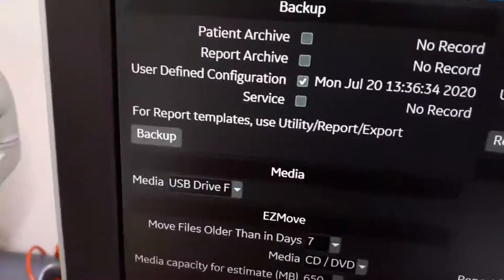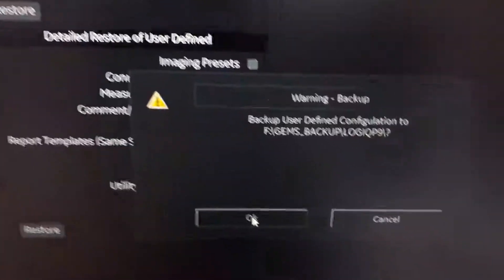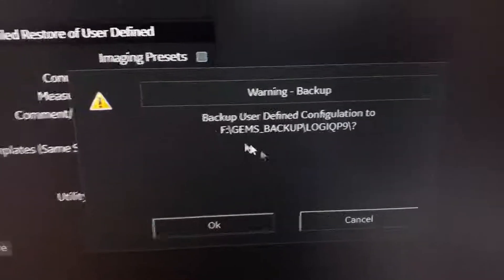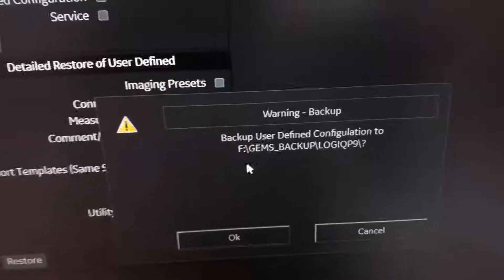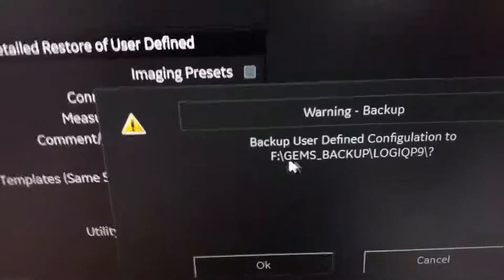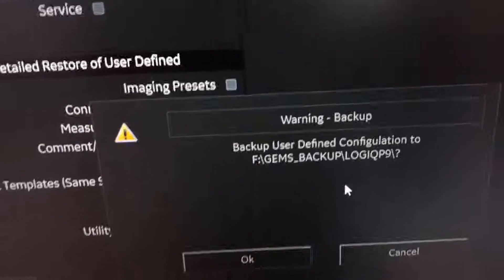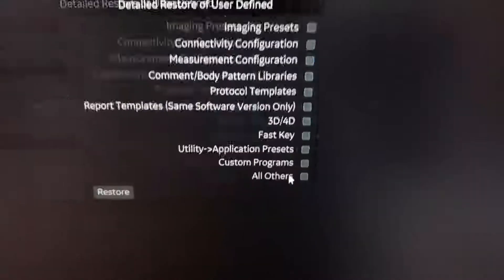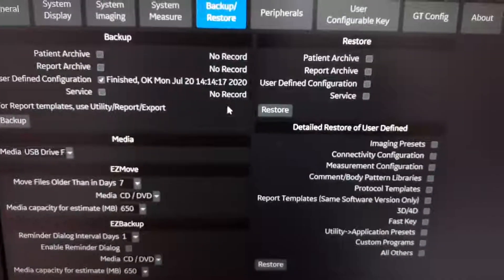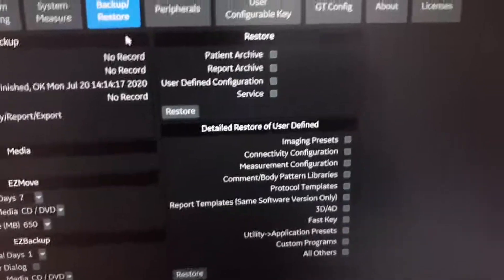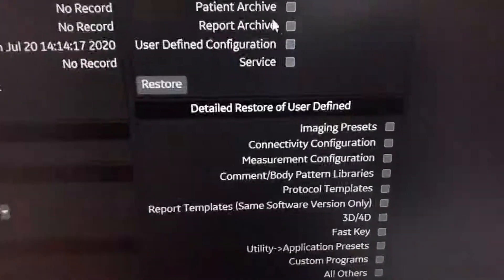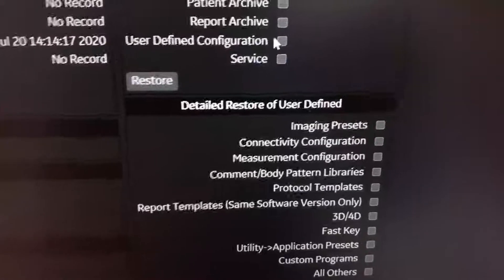Then press Backup. It gives a message that the backup will be saved in drive F, folder GEMS Backup Logic P9. Press OK. That's all — the backup is done.